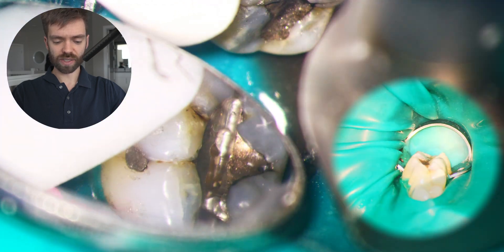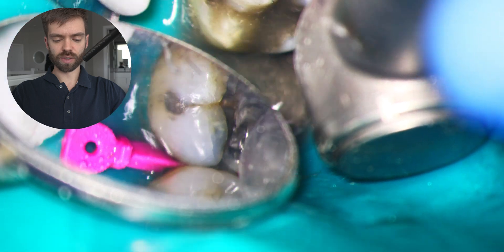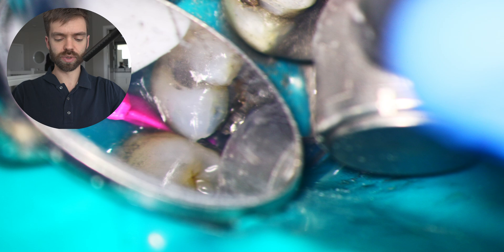Now I'm dividing that silver filling into pieces. I'm going to get to the bottom of the tooth in a second here. And there it is, that's the bottom. Now we just continue to divide the silver up so that each piece pops out as opposed to having to drill out every little bit of it. That way we create less mercury vapors.